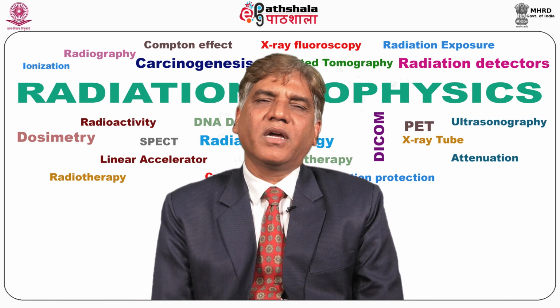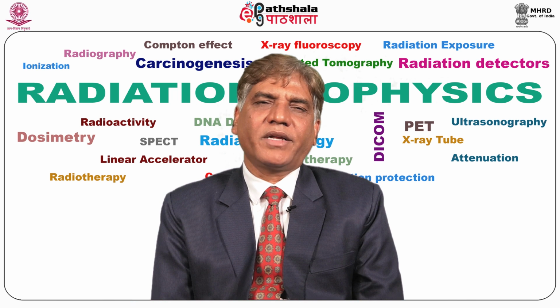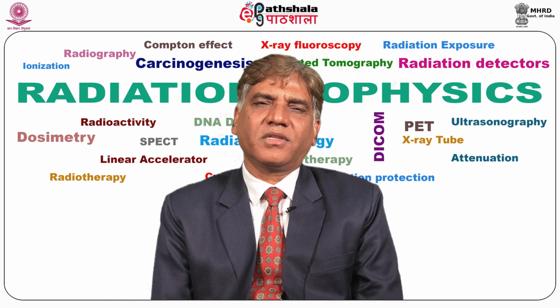detected by using a TFT, thin film transistor array, which is divided into detector elements and arranged in a rows and columns matrix. Electronic components include the TFT, a charge collector electrode, and a storage capacitor. The TFT is an electrical switch with 3 connections: the gate, an on and off switch, then the source attached to the storage capacitor, and the drain attached to the drain lines.